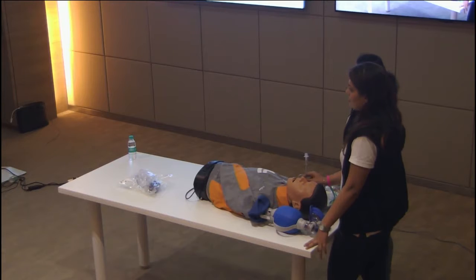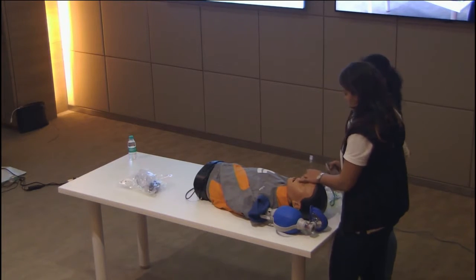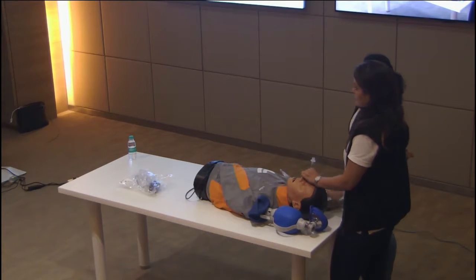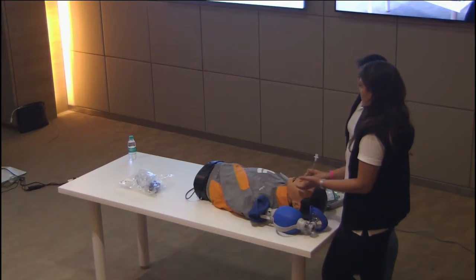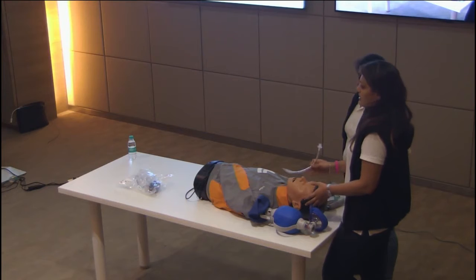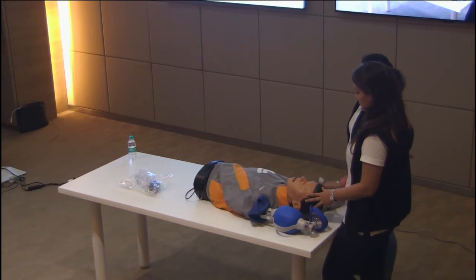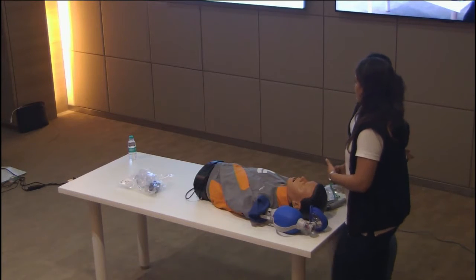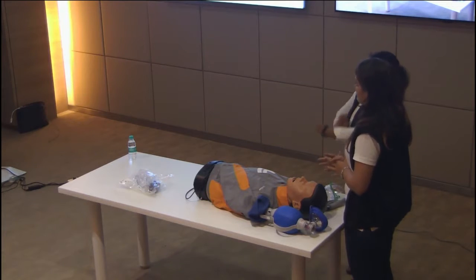This is just emergency management. We are not looking at the clinical scenario at all. What are we looking at? We're looking at pre-oxygenation, right? Have they done pre-oxygenation here? Yeah, we did. We applied a nasal cannula. We went for the face mask. We did NRBM. We have given sufficient oxygen to the patient, but it just didn't pick up. So that's what the doctor says. I mean, they've done pre-oxygenation, isn't it? They've used the nasal cannula, they've used the mask, and they've used the NRBM. Isn't that pre-oxygenation? Yes or no?